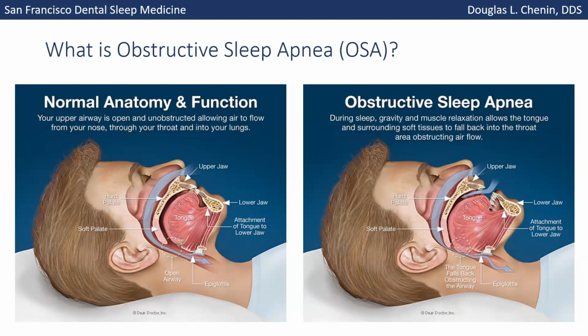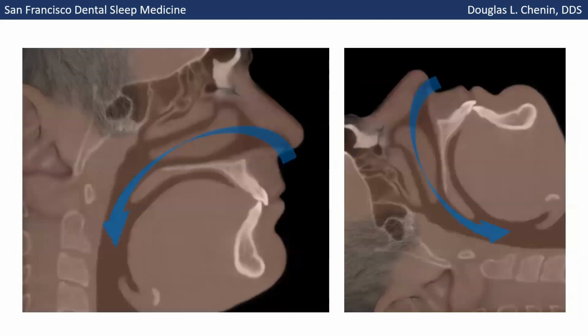And it's kind of an eye opener for many patients because most of the time the physicians didn't go through the anatomy. They just leave it as this elusive "your airway, your throat's collapsing." And patients often come to me wanting to get to the bottom of it. And really clearly and quickly, I can show them this picture. And if we take the cone beam, we see their tongue as well, and we can point it out.